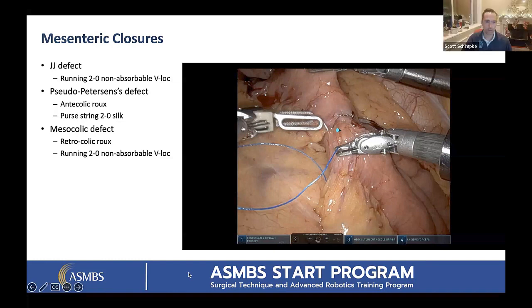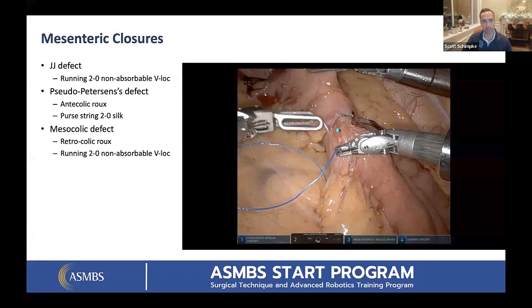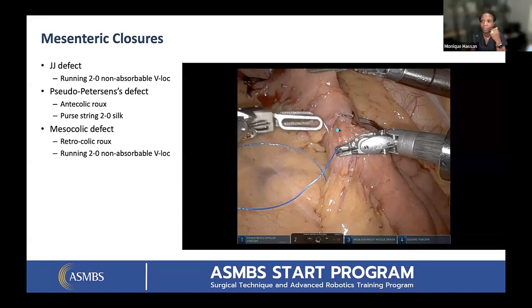One trick that I do is at the end of my mesenteric closure for the JJ, I do bowel to bowel, and basically I try to take that sharp corner out. That's kind of like my anti-torsion crotch stitch, whatever you want to call it. So it's part of my JJ closure. Kind of going back to the efficiency, that's another option. And again, it's voodoo. Nobody knows, but that's what I do. I agree, and that's what I do too on this closure. I'll try and roll bowel to bowel and get it up, so that it's really coming in as a gentle curve rather than flopping down on itself. But I don't know.